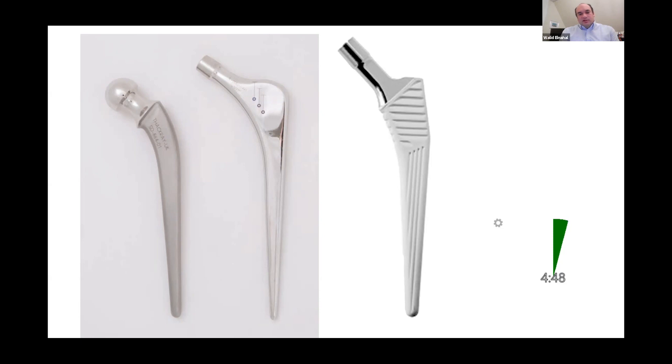To the right, the uncemented ones, they rely on biological fixation to the bone, so they either have pores for bone ingrowth or they have rough surfaces for bone ongrowth. With this one, this is the Corail stem, I believe, which is one of the most commonly used stems in the UK.